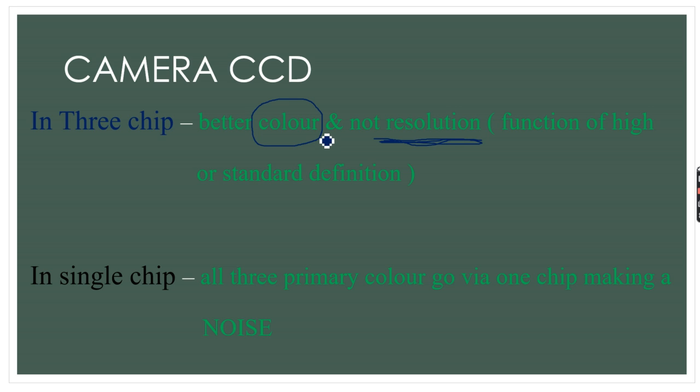As you already know, minimal access surgery is surgery over the image. This is how it is different from open surgery. In open surgery you are directly operating on the organs, and here you are just doing the surgery over the image. You are looking at the monitor and operating.